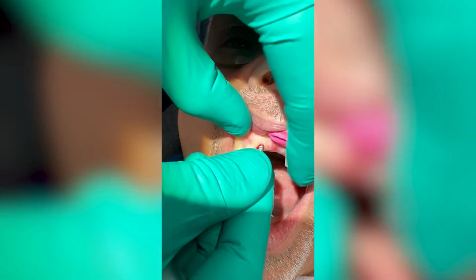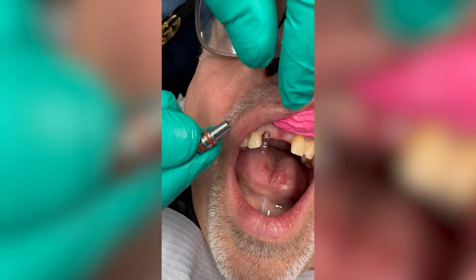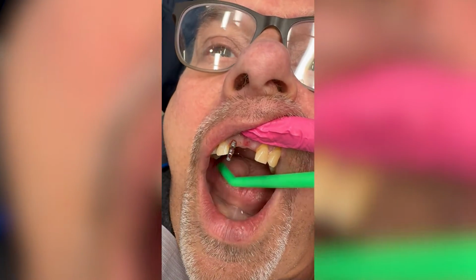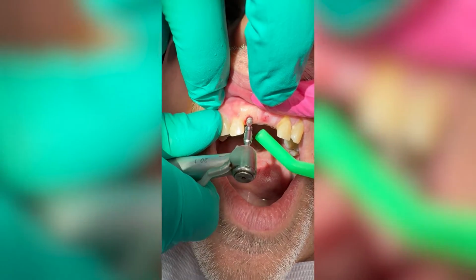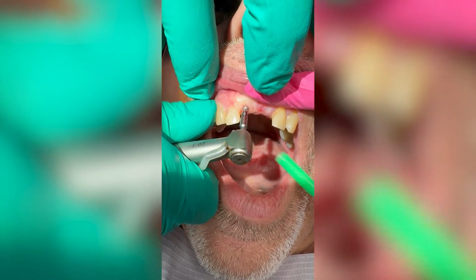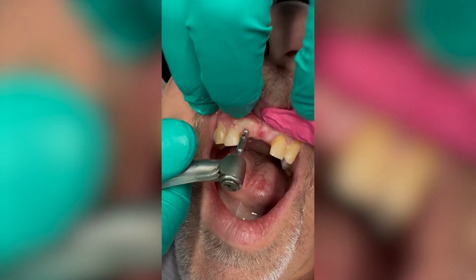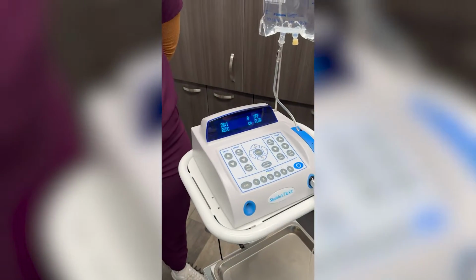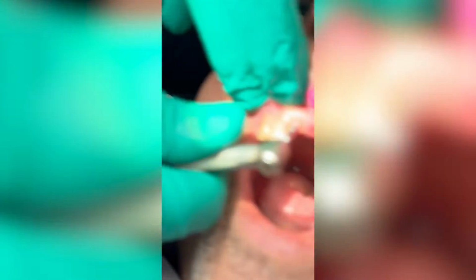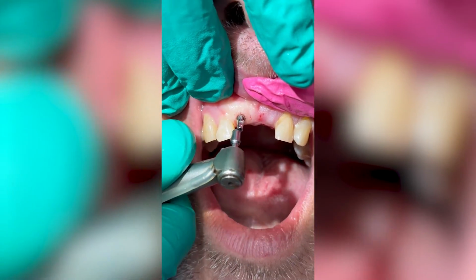So now I'm going to pull the carrier off of the implant. Now this is a disposable carrier that comes with every implant, okay? And we're going to go ahead with our contra angle driver through the implant, and now you hear the beeping. We've reached 30 Newton centimeters of torque, and the implant motor actually stopped at 30. So we're going to go up to 60 Newton centimeters of torque now. Show that on the motor that it's at 60 Newton centimeters now. Okay, and we're going to go ahead and place the implant the rest of the way, and it's beeping at 60 as well. So that's very, very good bone.